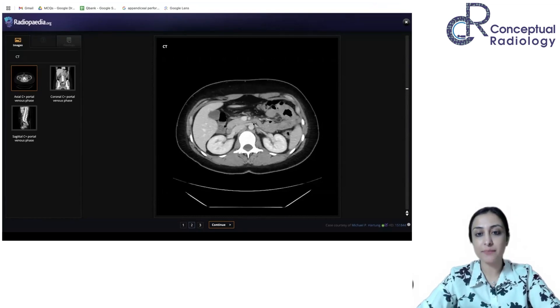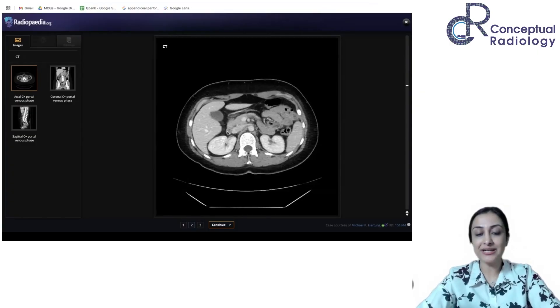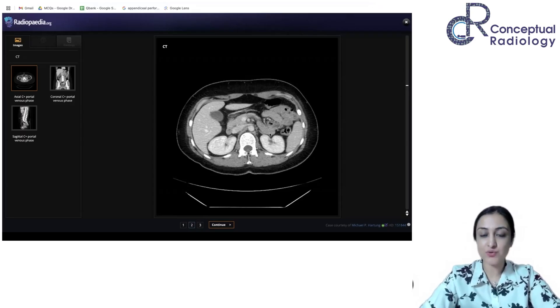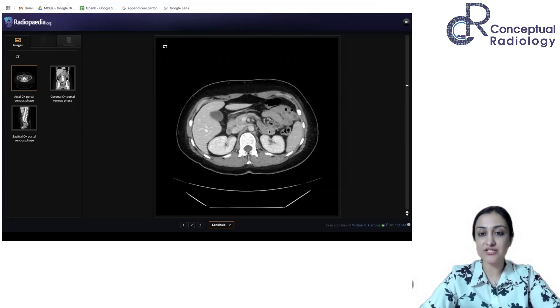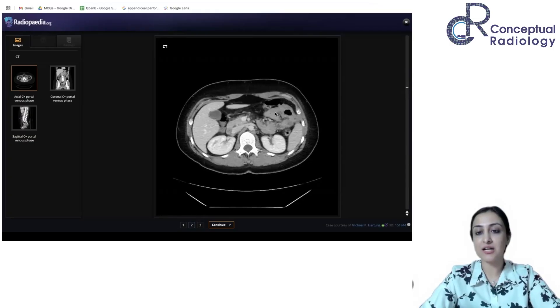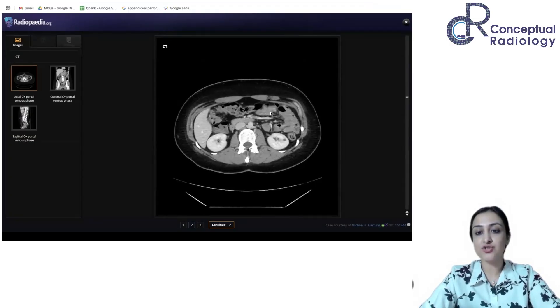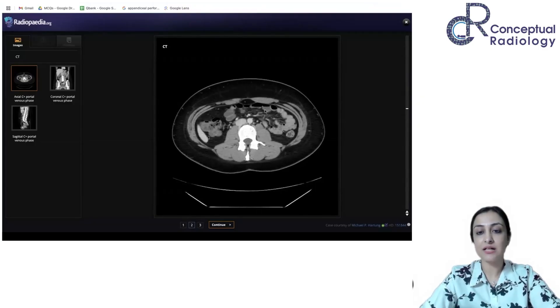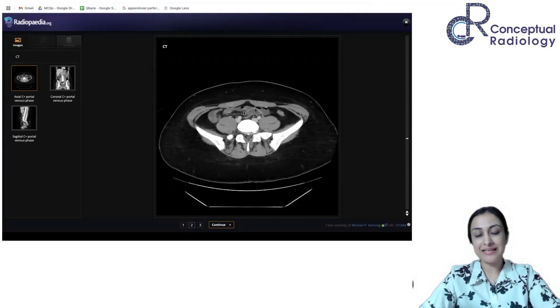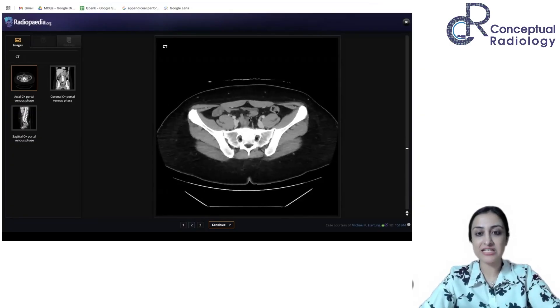Scrolling further up, you can see D2 is behind in the posterior part, and D4 is also behind — these are constituents of the anterior pararenal space of the retroperitoneum. Now you can see this is the DJ flexure, and all of these clustered loops are your small bowel — jejunal loops centrally, then ileal loops as we go caudally, filling the central part of the abdomen.